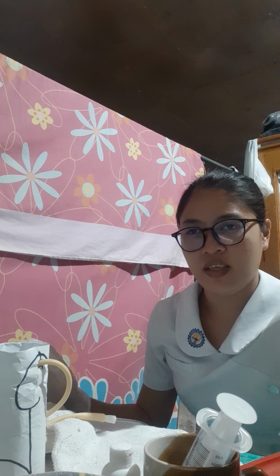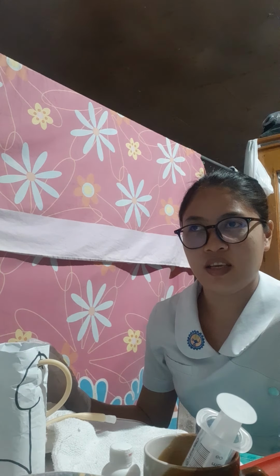And next, assess the client and the urinary output. We are going to assess the client's comfort, if he is comfortable or not comfortable, felt irritated, or has some pain in his lower abdomen, bladder part, or genitalia.